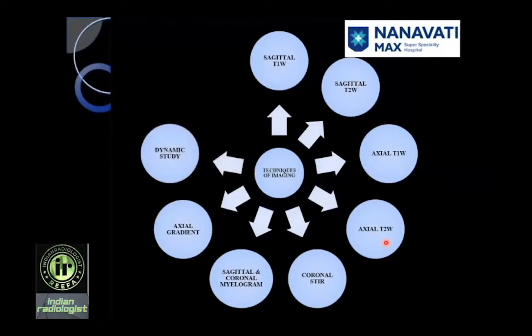A lot of people who have undergone wide laminectomies suffer from post-operative listhesis, which is best seen in flexion and extension studies. So a fast T2 sequence in flexion and extension, in addition to the neutral position, is also useful in the post-operative spine. At the atlantoaxial junction, when you are looking for atlantoaxial instability or subluxations, a flexion extension in dynamic mode is a necessity. Again, the slice thickness there is 3 to 4 mm.